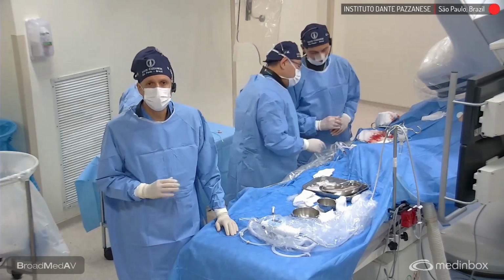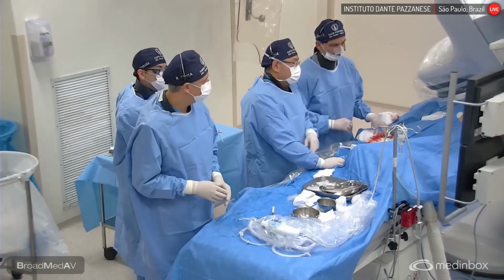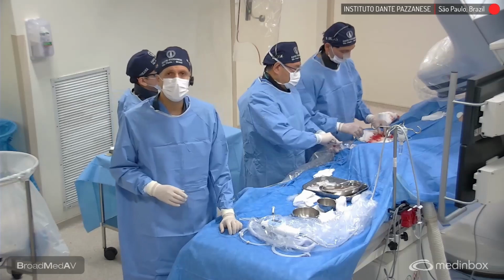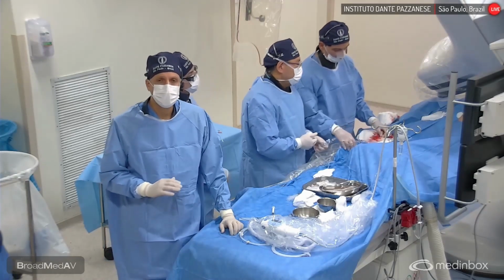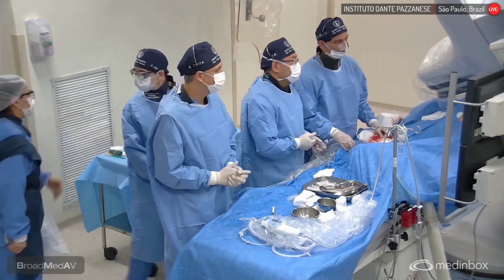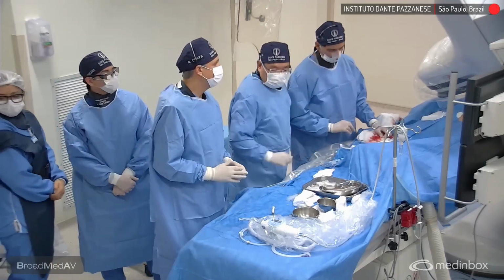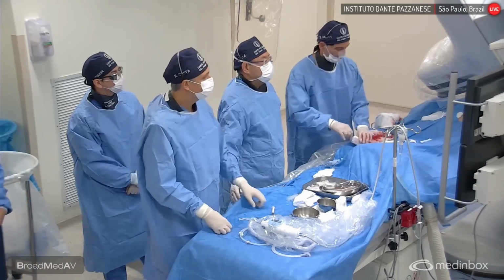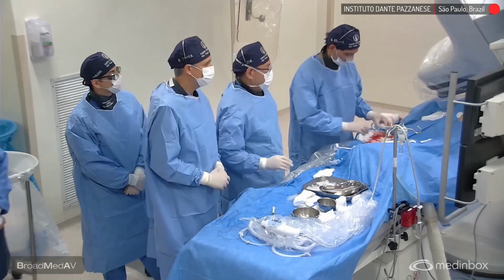So we have optimized this in the best way, and now we had the control angio. There's a bit of small extravasation at the body of the circumflex stent in the proximal part. Patient remained very stable, and now we're doing some prolonged balloon dilatation. So it looks like by angio things are solved, and maybe we can have a final control angio.